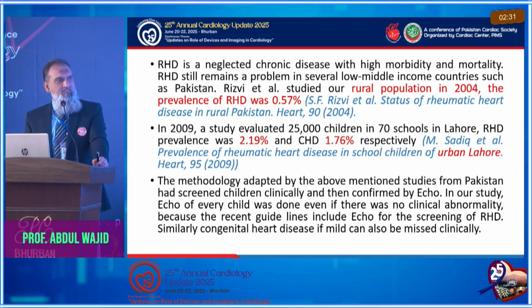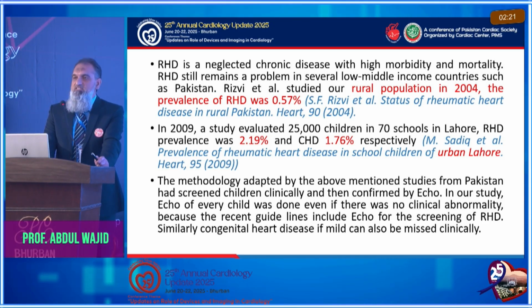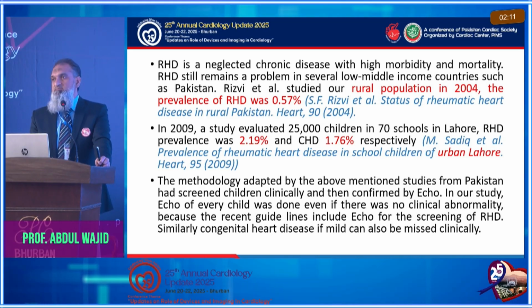The methodology adopted by the above-mentioned studies from Pakistan had screened the children clinically, not by echo. So the main difference between our study and the other studies is that we are screening the children primarily with the echo and main echo machine. We want every child to have an echo, because clinically and with handheld echo machines you can miss many.